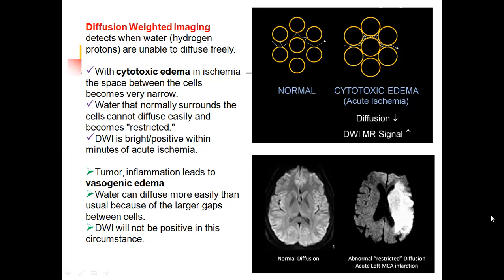Another regimen, one more regimen of MRI investigation is so-called diffusion weighted imaging. This regimen has many applications, but it is most often used in workups of ischemia and stroke pathology. It is important to have a rough understanding how diffusion weighted imaging works to properly interpret the images.